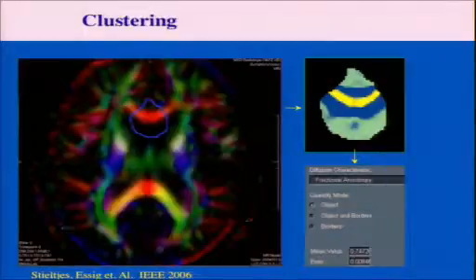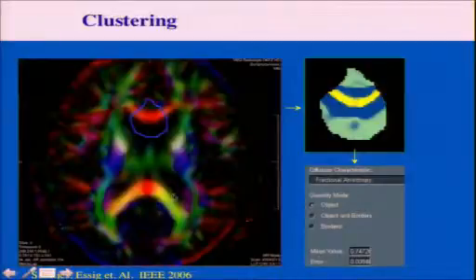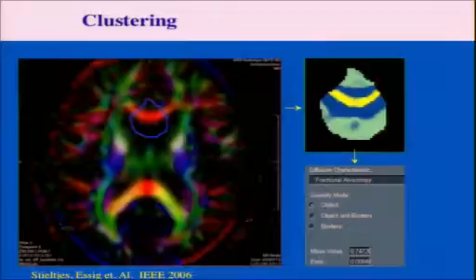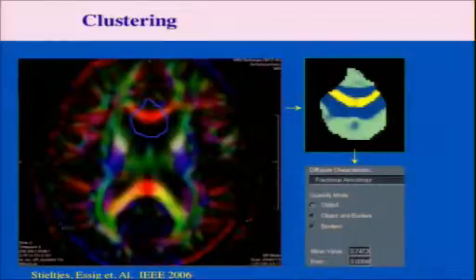What I think is the most promising technique in the workup of early stages of disease is diffusion tensor imaging. Diffusion tensor imaging, which we know mainly for tractography, has also more information in it. It has information about the integrity of structure or fibers. So whenever a fiber loses its integrity, the so-called fractional anisotropy, a quantitative marker that we can extract from our diffusion tensor imaging data, is reduced.